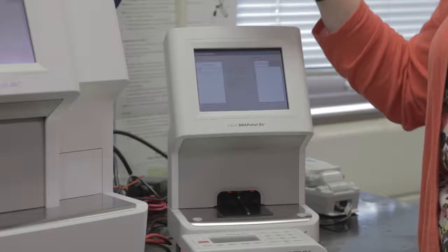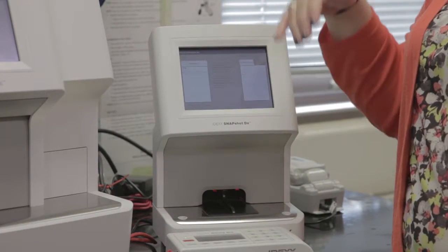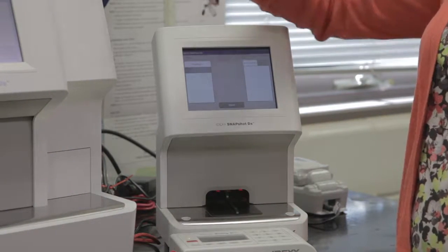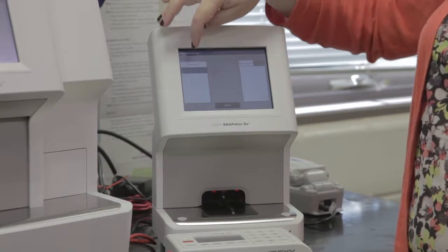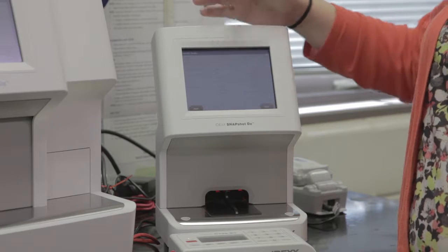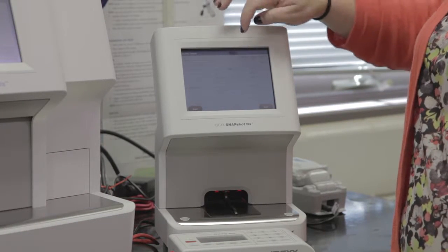You still are responsible for snapping the test down and inserting it into either well, and you're just going to tell it what type of test you're running. So for this patient, the touchscreen on this is just like the one on the Catalyst. So your patients will be in the pending list. We're going to choose our patient, and then we have to tell it what type of SNAP test we're running. So I'm going to say we're running a heartworm test.